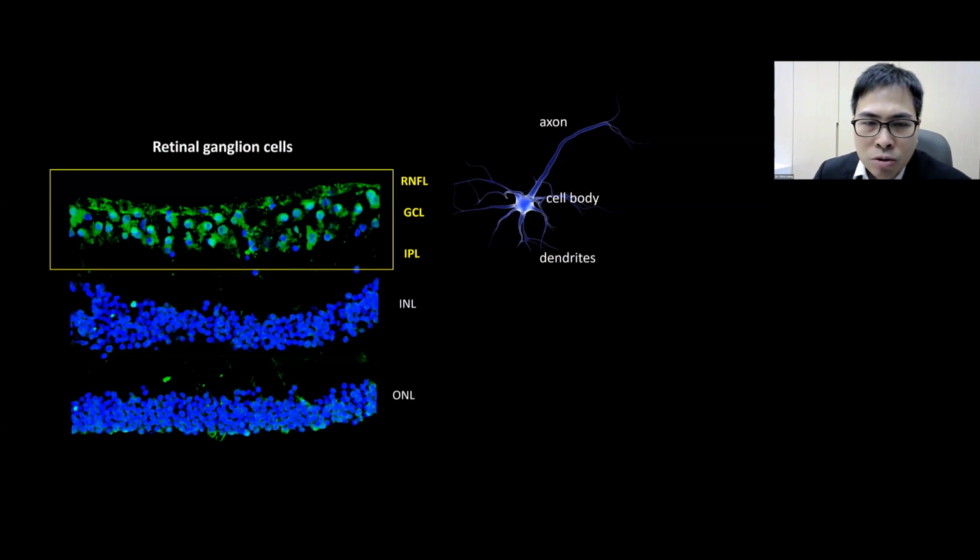We image the retinal nerve fiber layer because, as I mentioned, the retinal nerve fiber layer is the axons of retinal ganglion cells. But we also need to study the macula. The reason here is that a lot of times, some early defects can be missed over the peripapillary region. I will show that to you in the next slide, but I would like to demonstrate here the anatomy of the retinal layers.